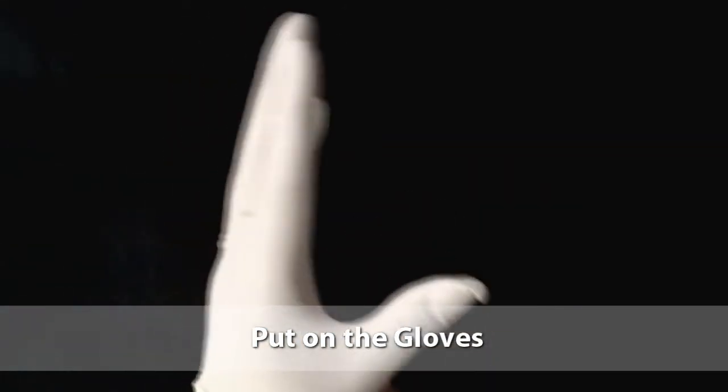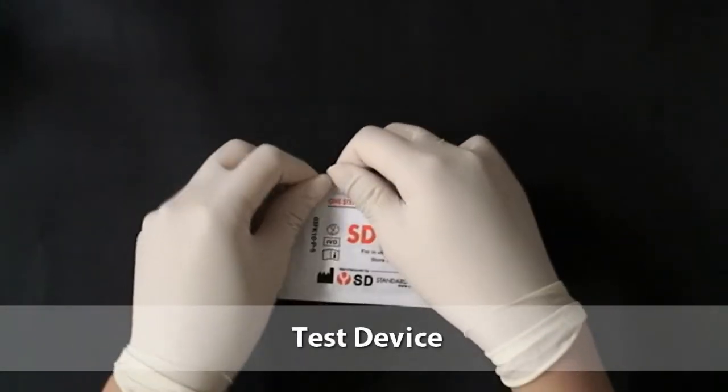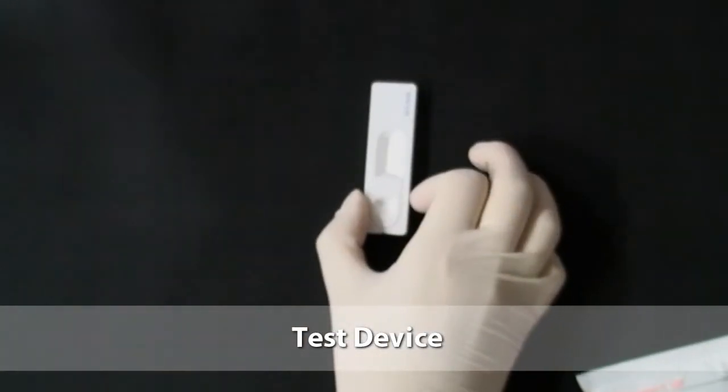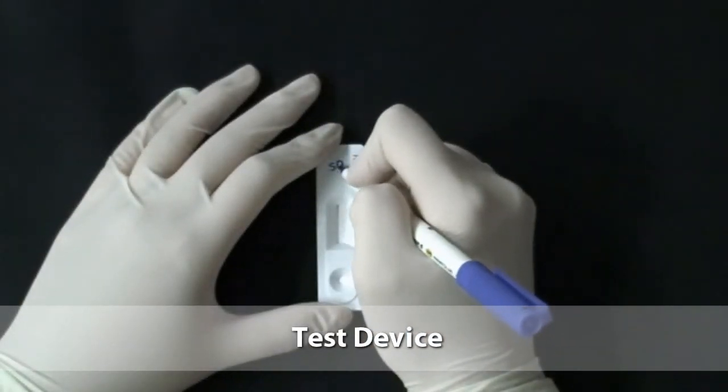Put on the gloves. Remember, use new gloves for each patient. Open the test pouch and set the test device. Write the patient's name on the test.